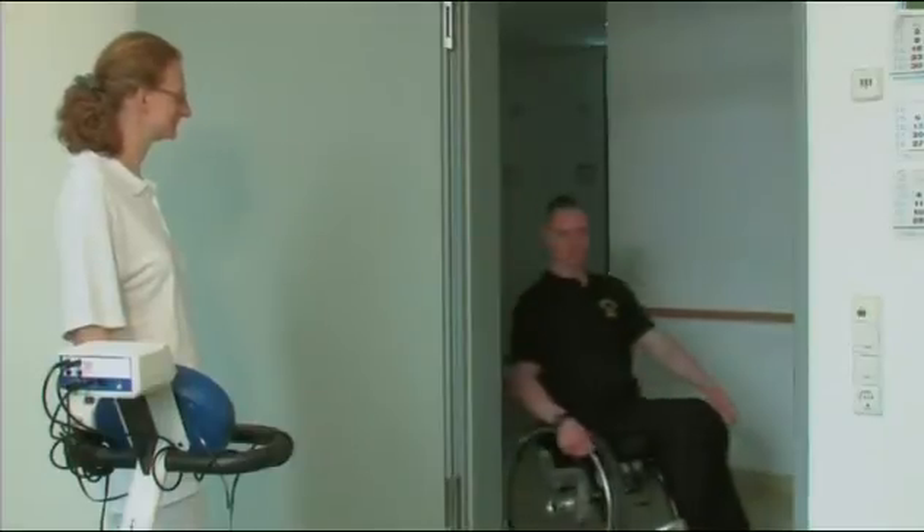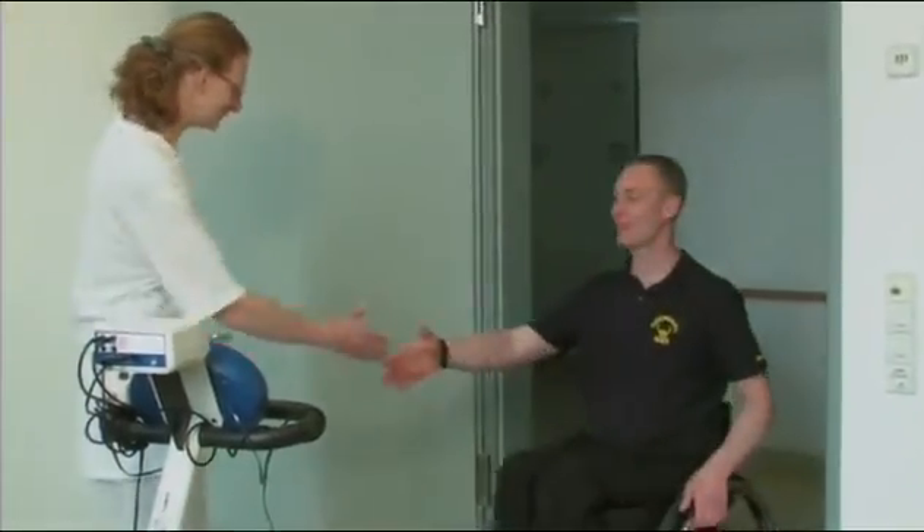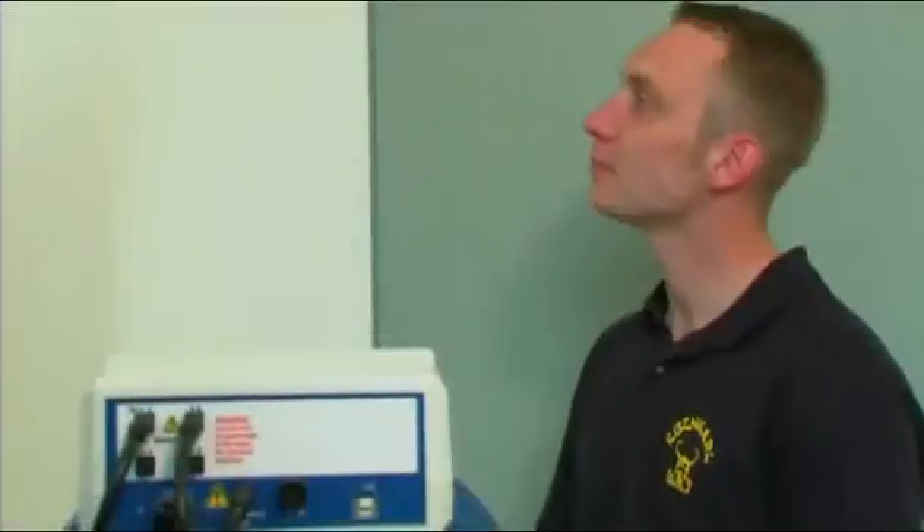Here in the therapy center, people are treated with RehaMove. Exercising with a paraplegic patient, we can demonstrate the functionality and application of the device.